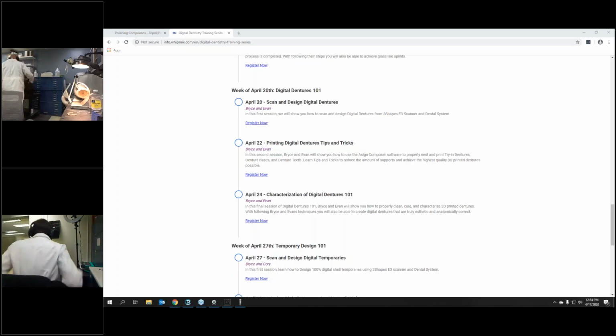I also have a model for this splint here that I printed for the customer as a sample. Let me grab that as well. It was designed as if it had retention on it. Let me go grab it real quick. And it has a little bit of a snap, but it does fit. And I'm guessing when it was designed, the retention amount was most likely set to 50 microns. So there's a little bit of a snap to fit.